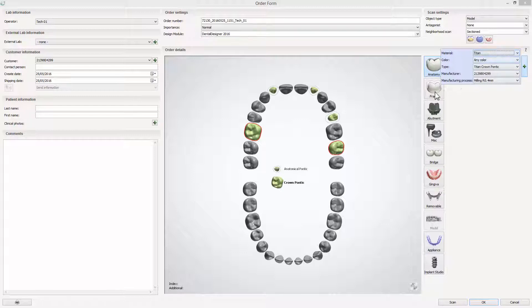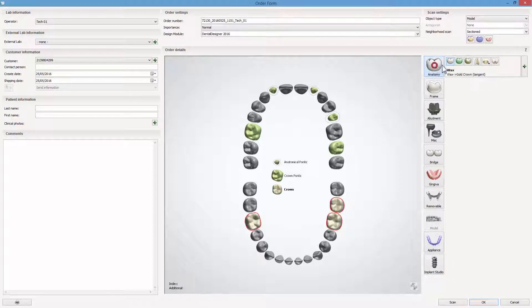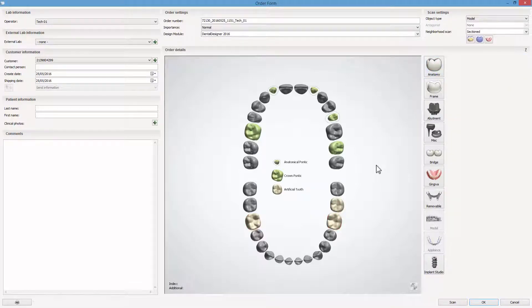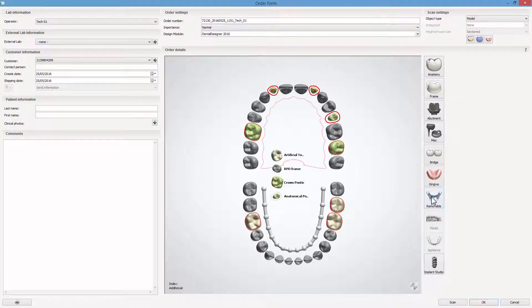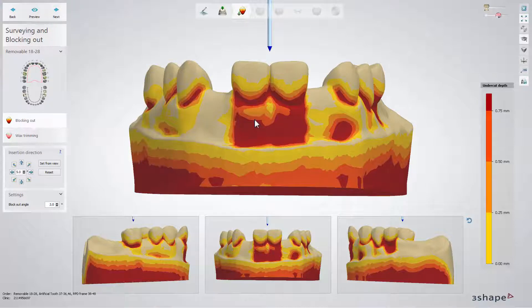Last but not least, for the antagonist preparation, we are choosing teeth 36, 37, 46 and Anatomy Artificial Tooth. When you've done that, select all teeth and click on the Removable tab. Remember that all materials and the manufacturing process for each tooth should be the same. Scan models or import scans and move to the Dental Designer.